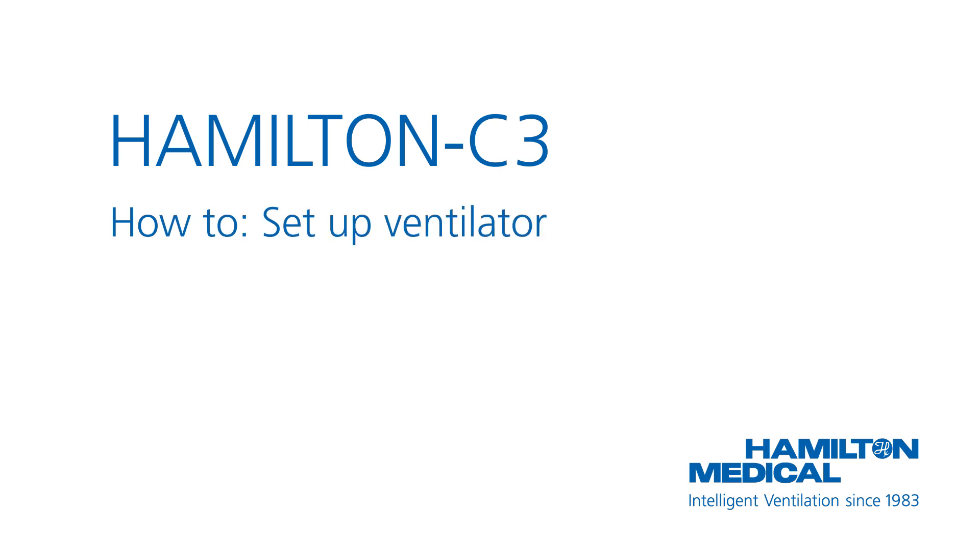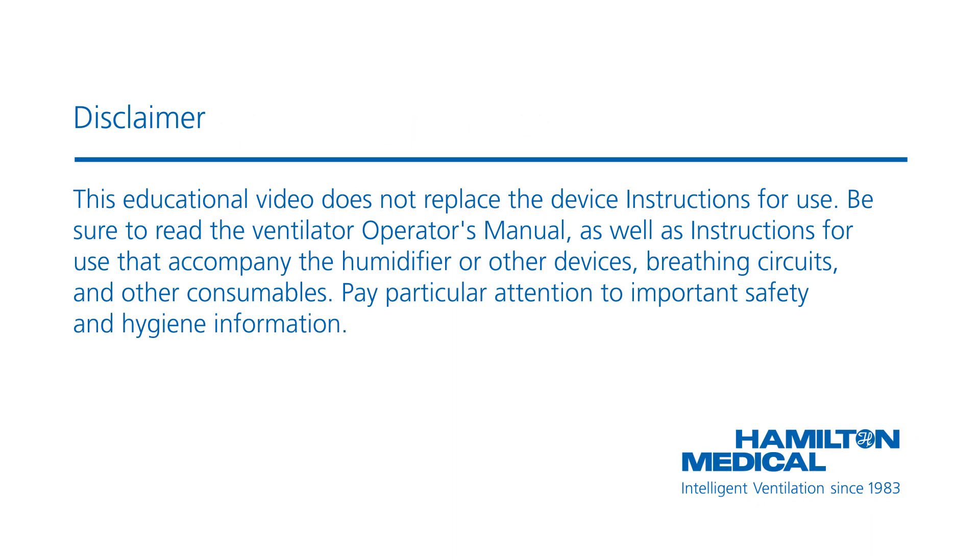This how-to video will show you how to prepare the Hamilton C3 ventilator for use. This educational video does not replace the device instructions for use. Be sure to read the ventilator operator's manual as well as instructions for use that accompany the humidifier or other devices, breathing circuits, and other consumables. Pay particular attention to important safety and hygiene information.